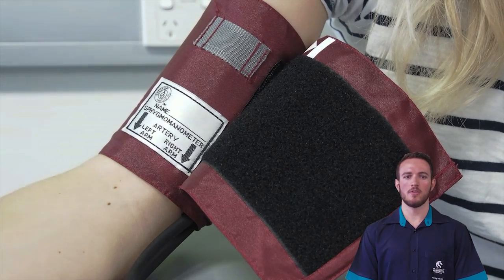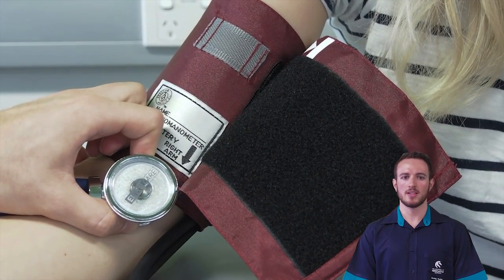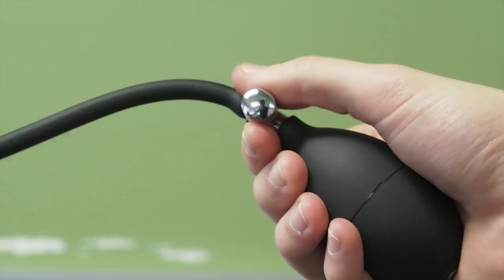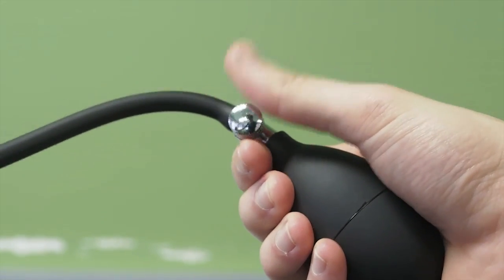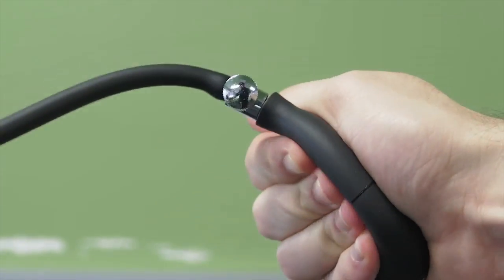Next, position the stethoscope over the brachial artery. Use the bell of the stethoscope if possible, as it picks up lower frequency sounds. Use your thumb and index finger to hold the stethoscope over the brachial artery. Now close the pressure valve and inflate the cuff until the manometer registers 30 millimetres of mercury above the initial palpation reading.